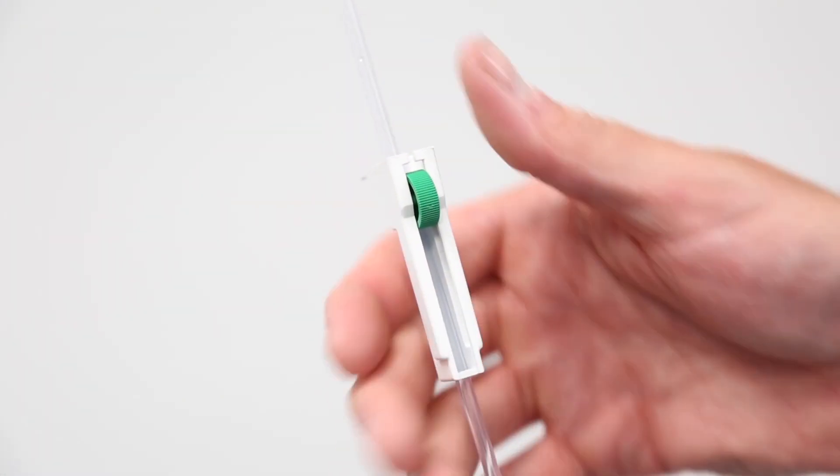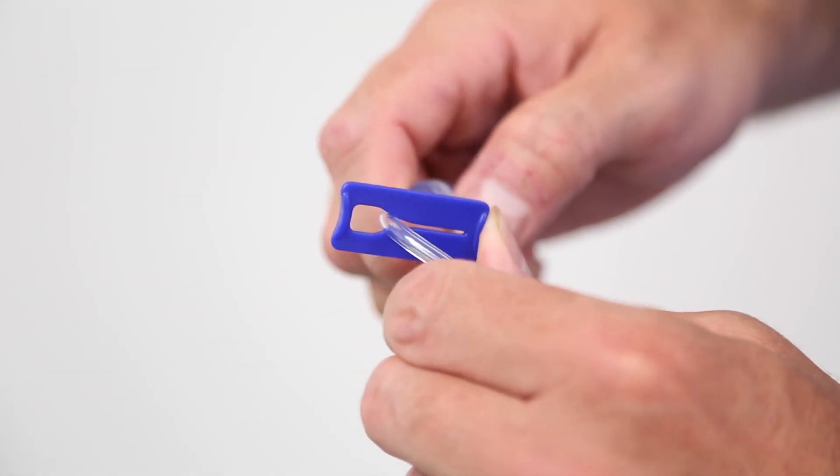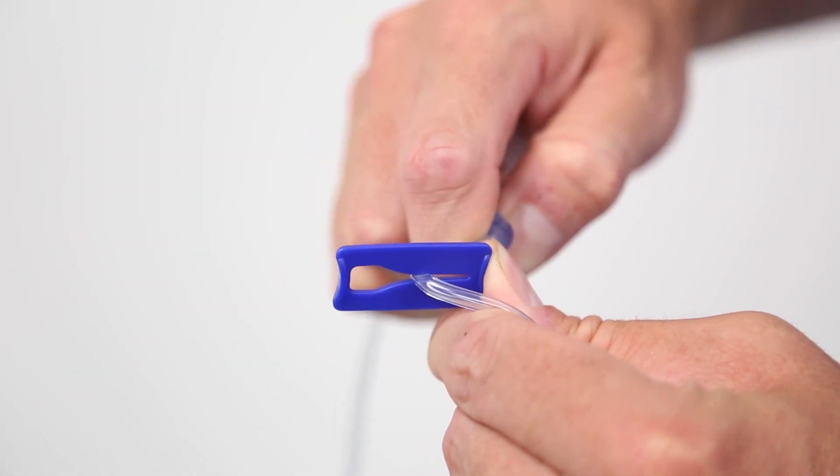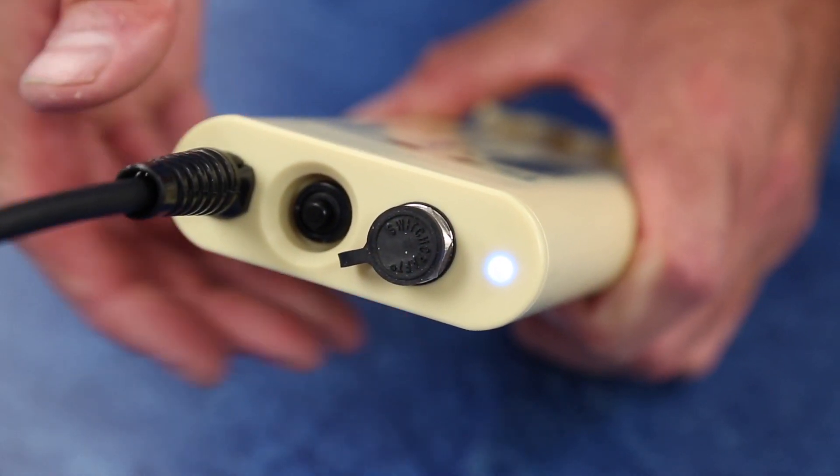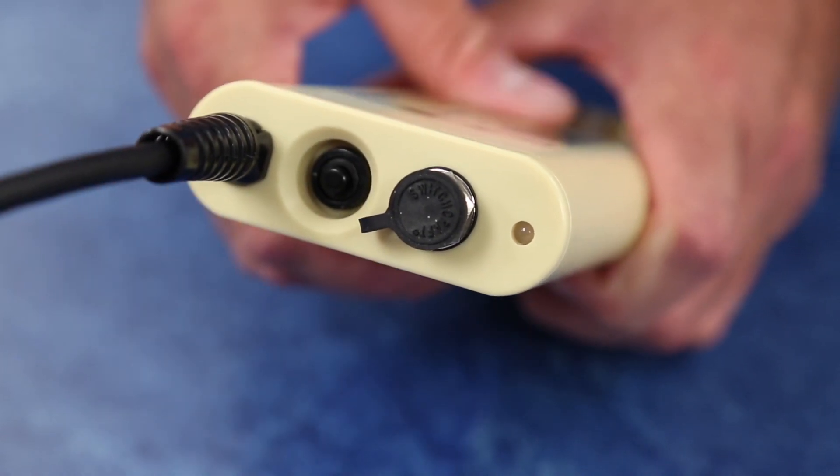At the end of the procedure, close the roller clamp on the administration set and then close the input end of the disposable set using the blue side clamp. Turn off the heater by pressing the on-off button on the battery housing.